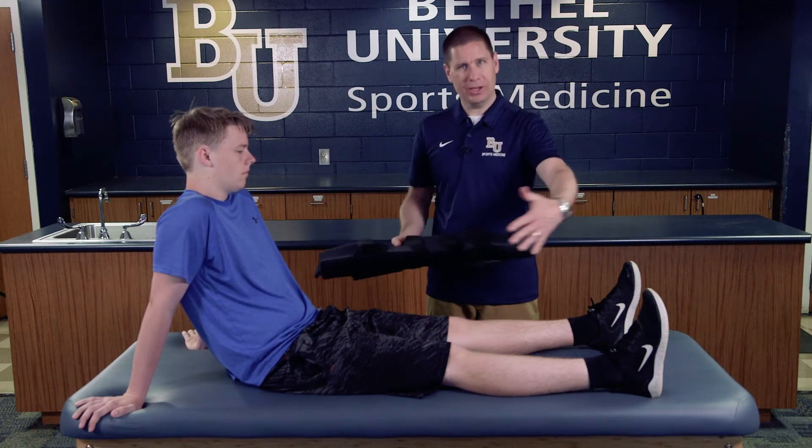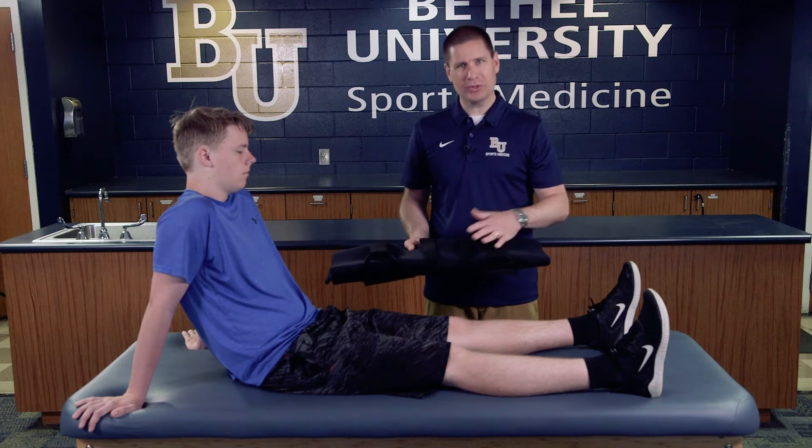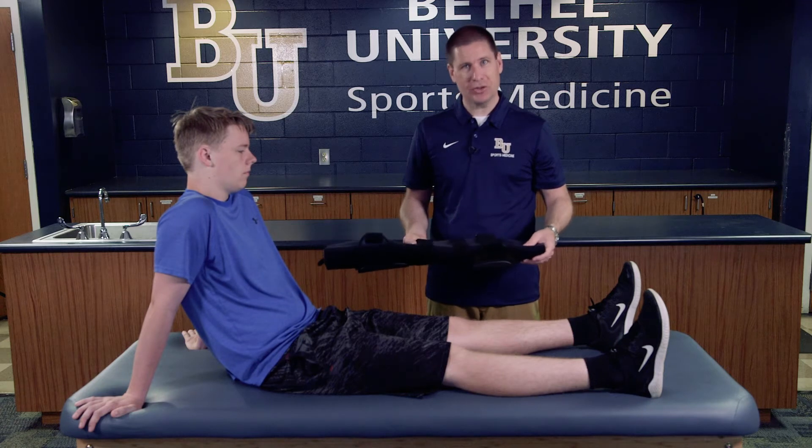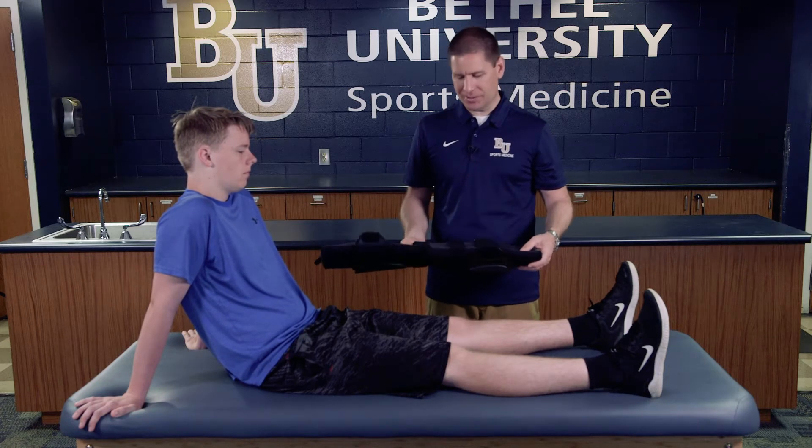Most of them also come in widths. This one is a little bit more universal — it kind of wraps around and takes care of any particular width. That's a nice advantage of this particular one, as it's fairly adjustable in terms of size.